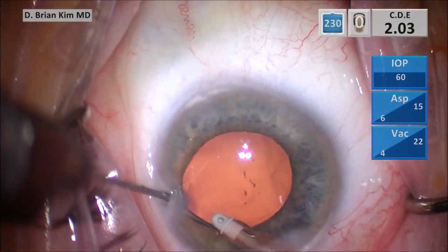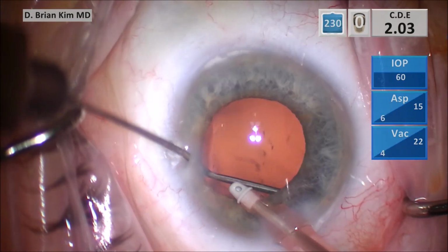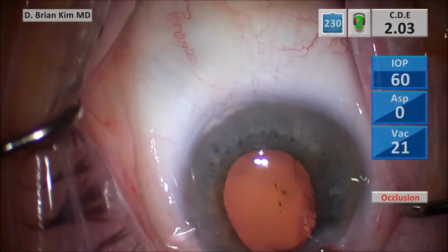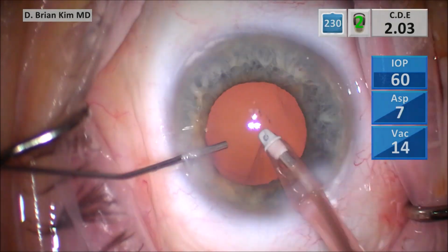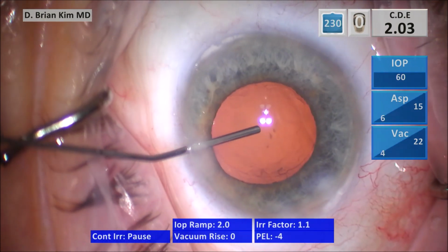By using mechanical forces, you're essentially placing the instruments around the lens and crushing it. And you don't need any vacuum to do this. So this is a very safe and very controlled way to disassemble the lens, especially in the context of a floppy iris. Number 3, never grab lens pieces with the phaco tip.